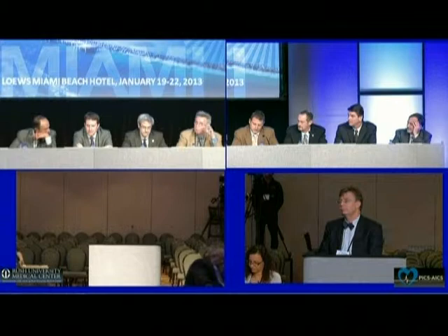I realize that it won't be the 450 square foot typical cath lab where you could jimmy rig a biplane system in and nobody could move around. It's the fact that the number of people and instruments and machines and everything that come into the lab now are going to dictate the size. It won't be the X-ray equipment. Yeah, sure, but you and me and Jackie are not going to get any smaller, so we've got to make the equipment smaller.